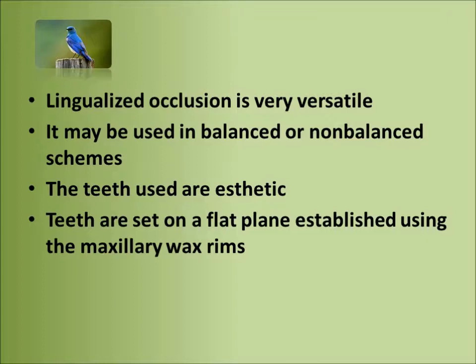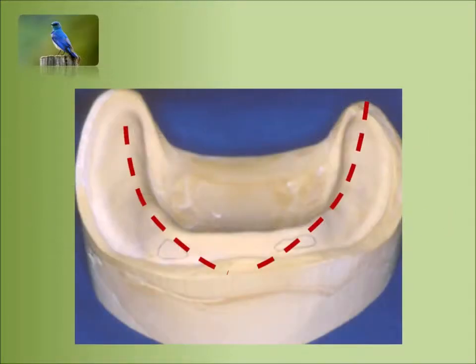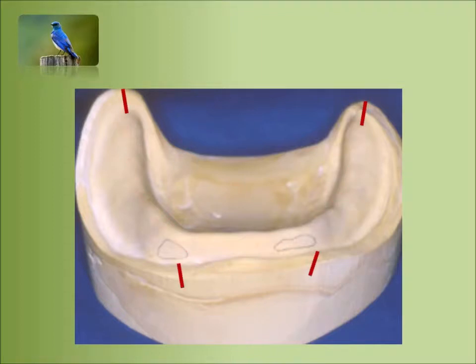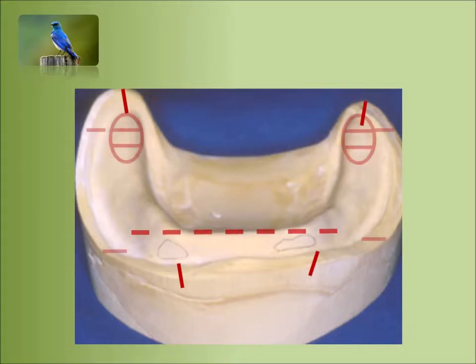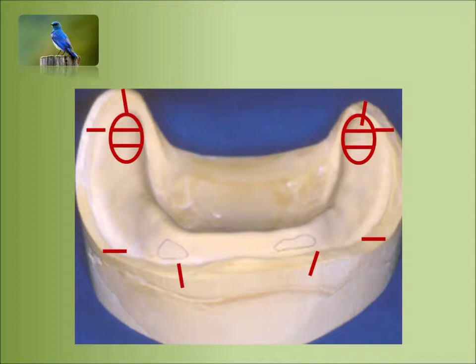The mandibular teeth are usually monoplane or semi-anatomic. The teeth are set on the middle of the ridge, with the entire occlusal surface flat against the maxillary occlusal plane. Landmarks are placed on the cast denoting the middle of the ridge, position of the cuspid, and the retromolar pad. The retromolar pad is divided in two-thirds. The mandibular occlusal plane approximates a line running from the upper two-thirds of the pad to the incisal edges of the maxillary teeth.